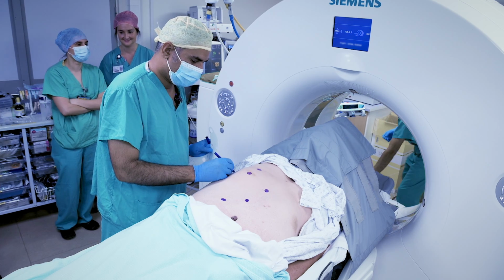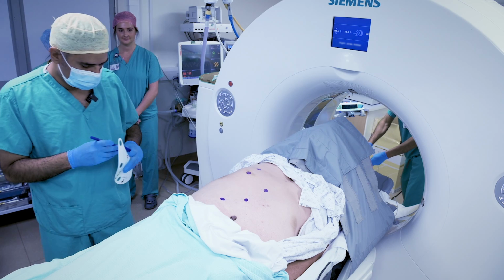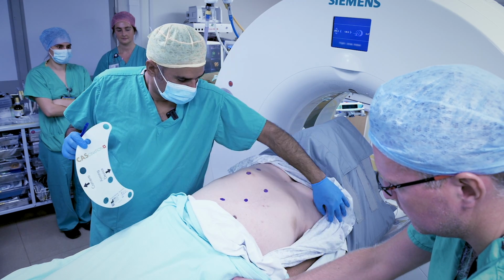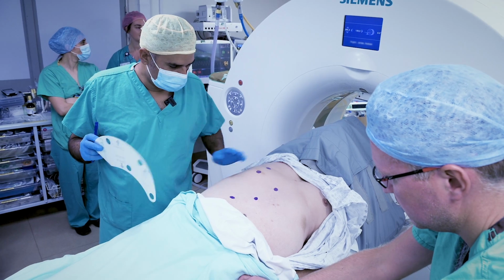In our practice, we've found that the most efficient way to do it is to have the anaesthetic machine to the patient's right and the anaesthetic circuit running through the top, through the CT gantry, such that nothing else is in the way or interfering.